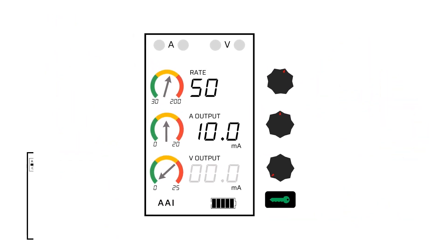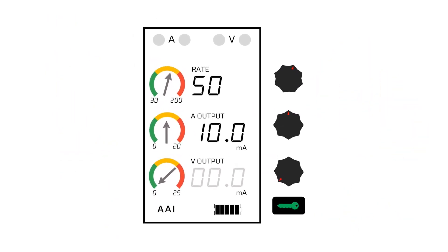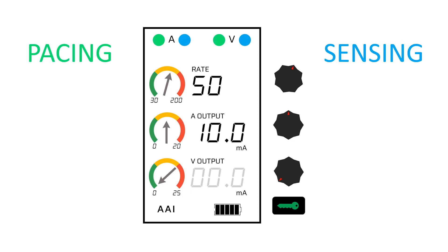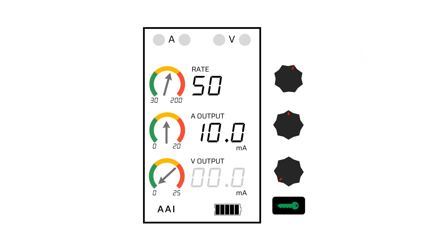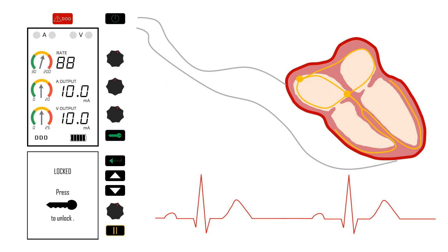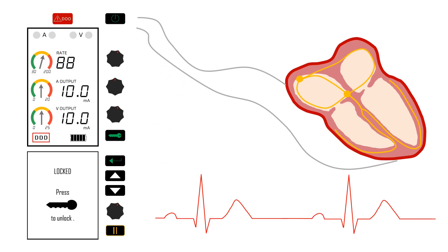We can see if the pacemaker, or pulse generator, is sensing or pacing by looking at the lights at the top of the screen. Blue lights indicate sensing and green lights indicate pacing. The blue lights will flash when electrical activity in the heart is sensed, and the green lights will flash when the pacemaker generates a pulse to pace the heart. Here, the pacemaker is in DDD and the heart is in sinus rhythm with normal conduction. First, the pacemaker senses the intrinsic atrial activity through the atrial wire, and then it senses the intrinsic ventricular activity through the ventricular wire. We can see this sensing as the blue lights flashing on the pulse generator screen.